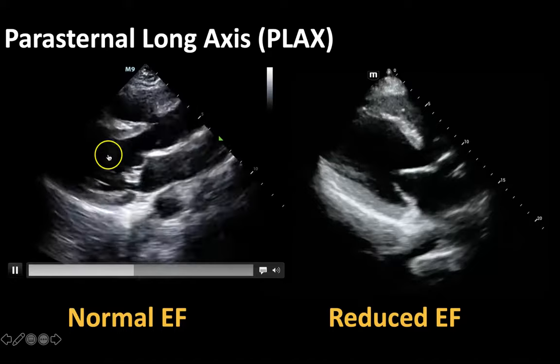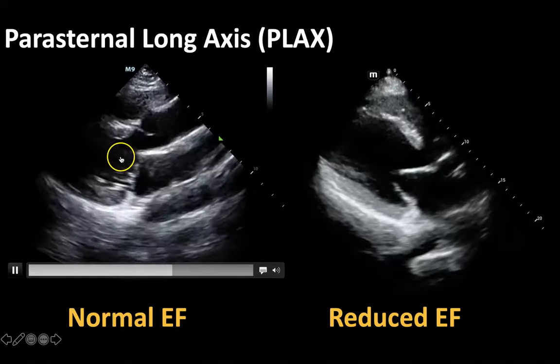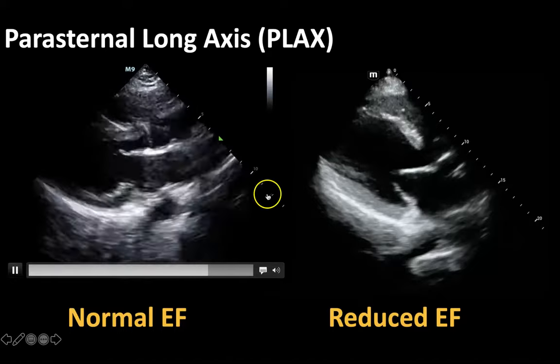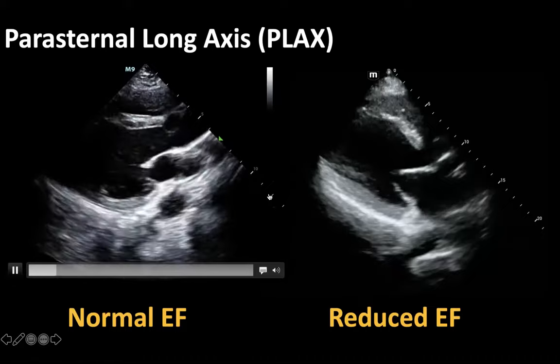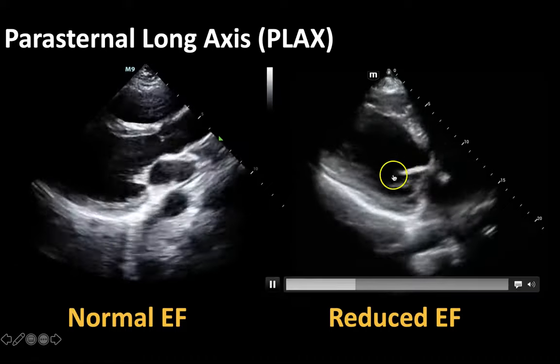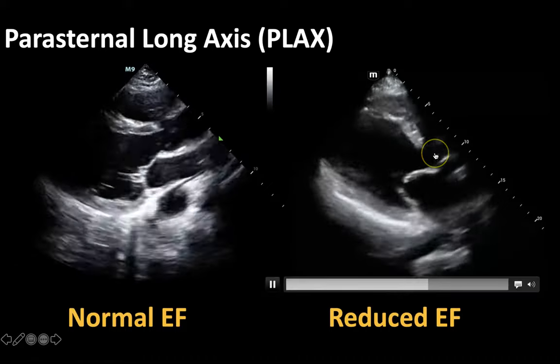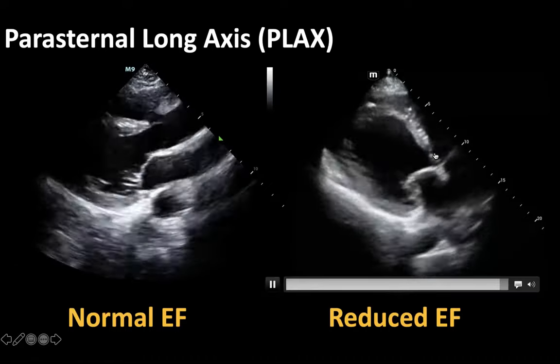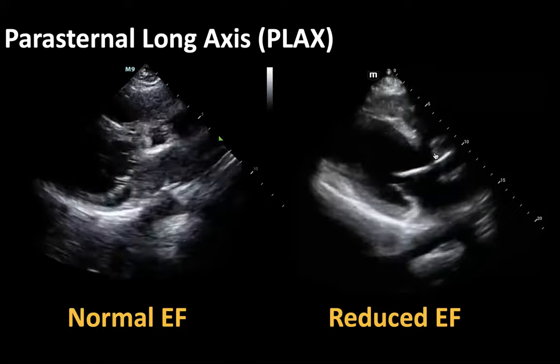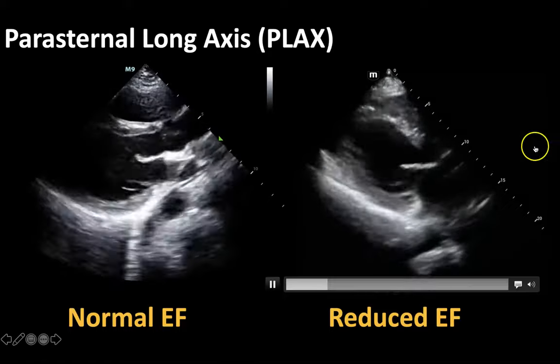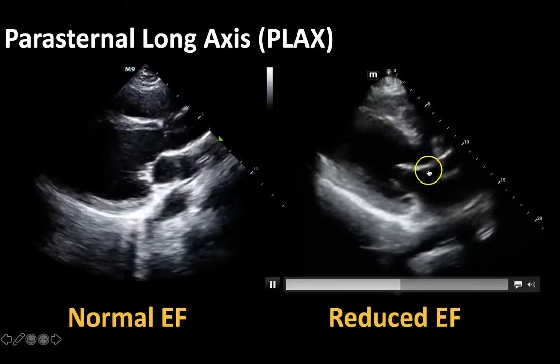This will become more obvious when I show you the second heart and you compare the squeeze between these two hearts on the screen. This is another parasternal long axis view, and I want you to draw that imaginary line in the middle of that left ventricle.